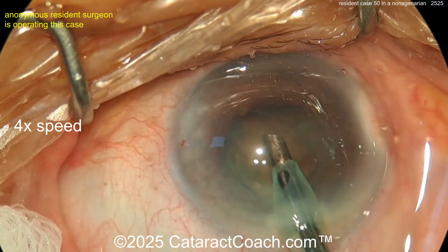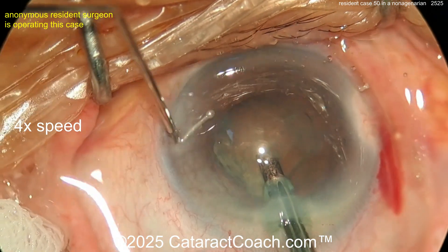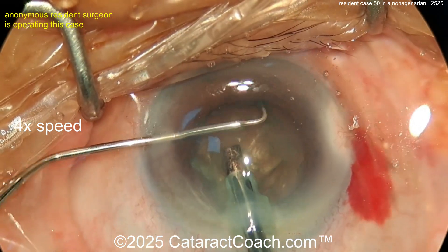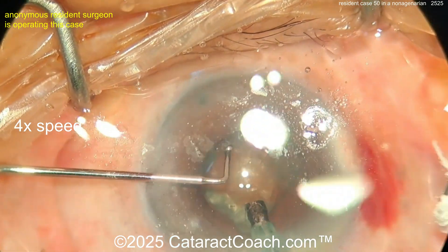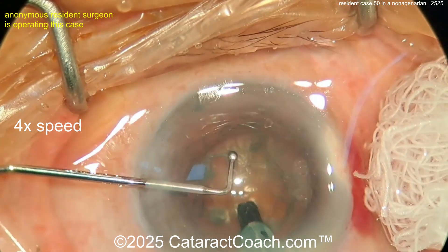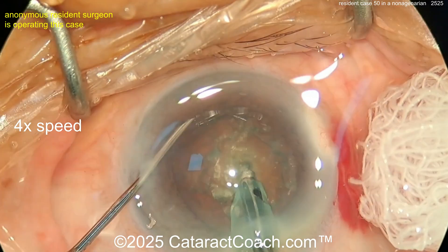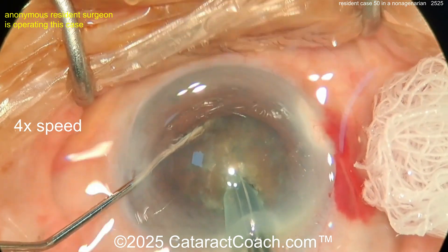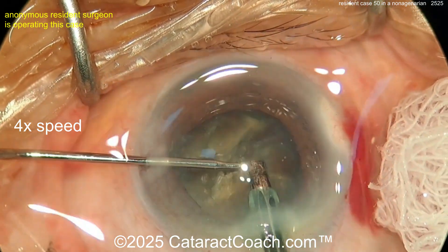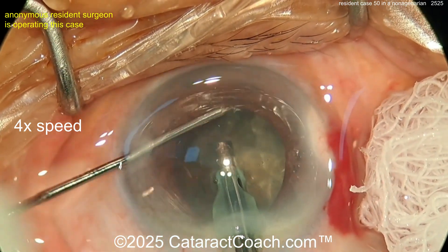Let's see the cleanup — get the eye down. I want those Purkinje images in the center of the cornea, and it's harder to do that sitting superior instead of temporal. There goes the chopper — that's a big chopper, make sure where you're placing it. Buzzing with the phaco probe, hold the nucleus, get that chopper around. The visualization is a little tough here. That's a scary maneuver, but that's a nice crack — nice chop, you did it! When fluid pools on the surface of the eye it really makes your view difficult.